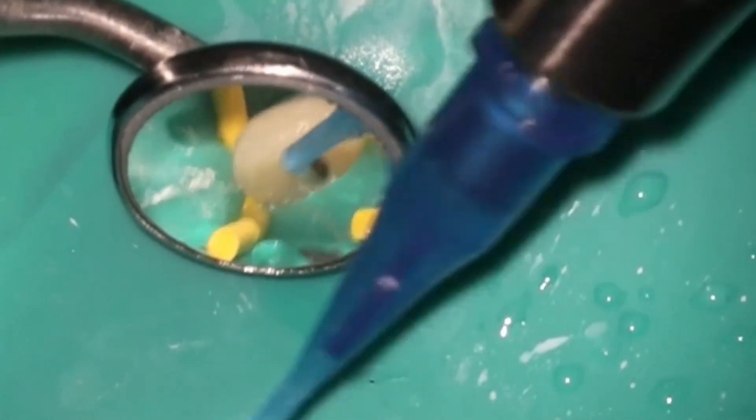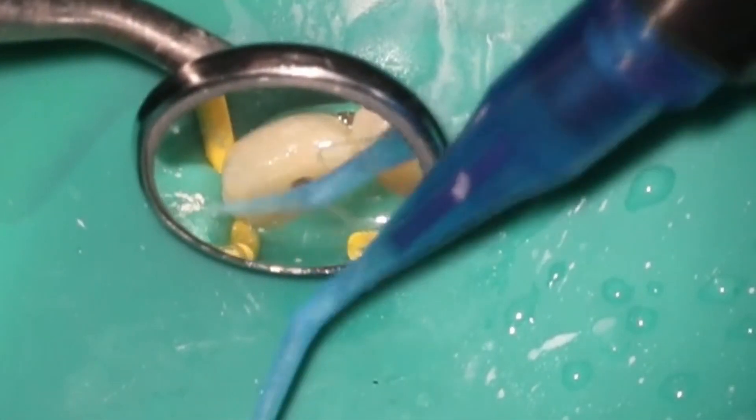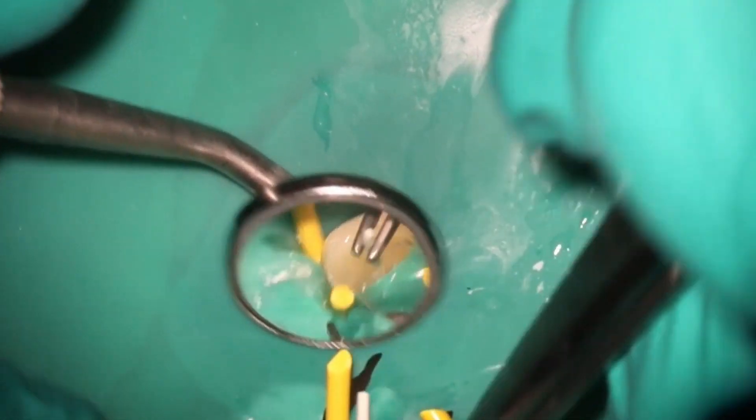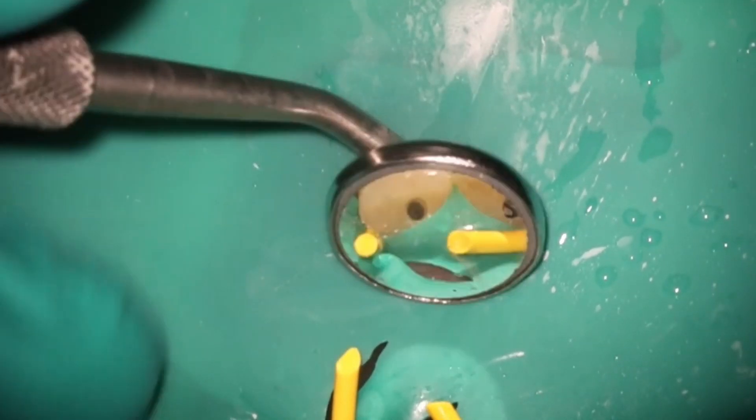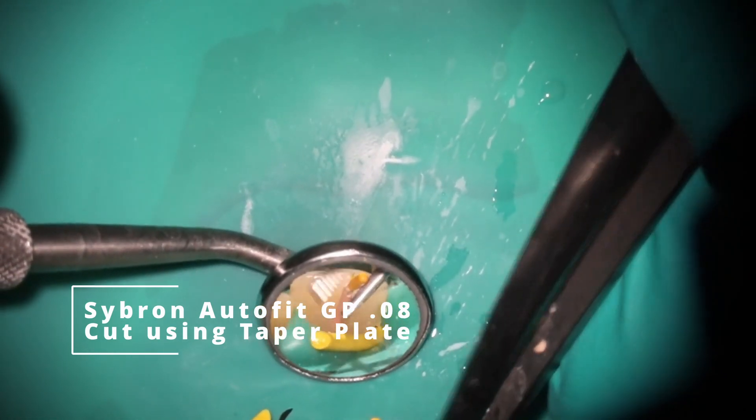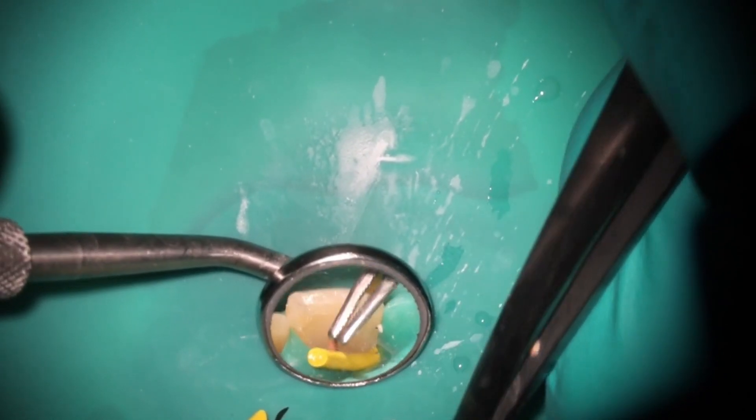Going back in with that micro suction like we did before, and at this point you can see those paper points are nice and dry. What I'm going to do here is actually confirm the length. You can use a bleeding pointer in this case — it was just slightly wet out the apex, and that will actually help you confirm the length. You'll see that it kind of exits out to the side. I am not doing squirt fill on this case.